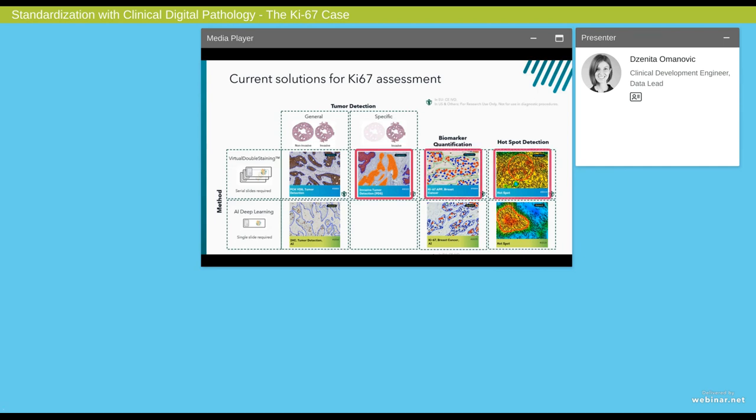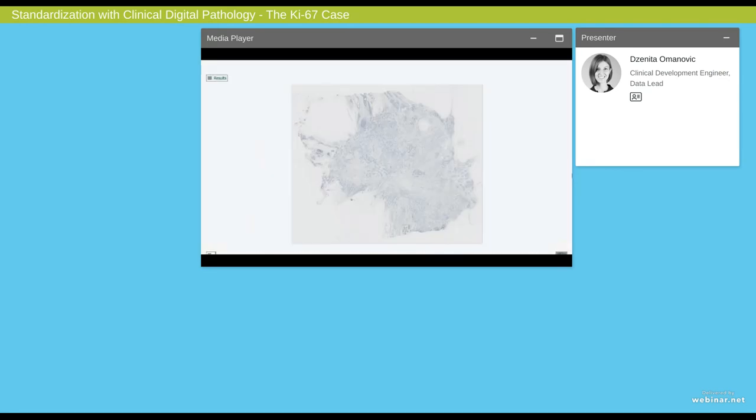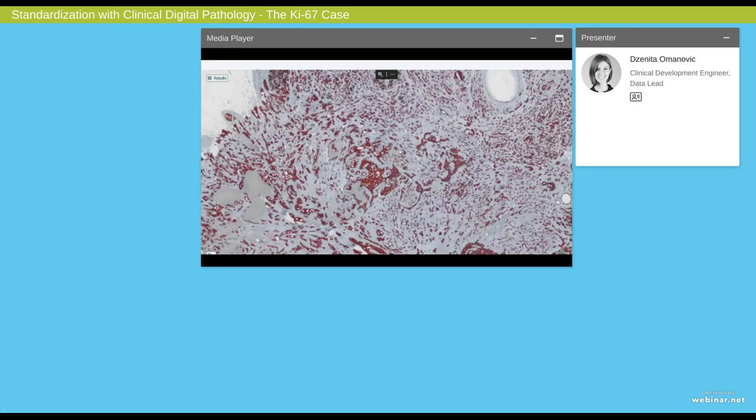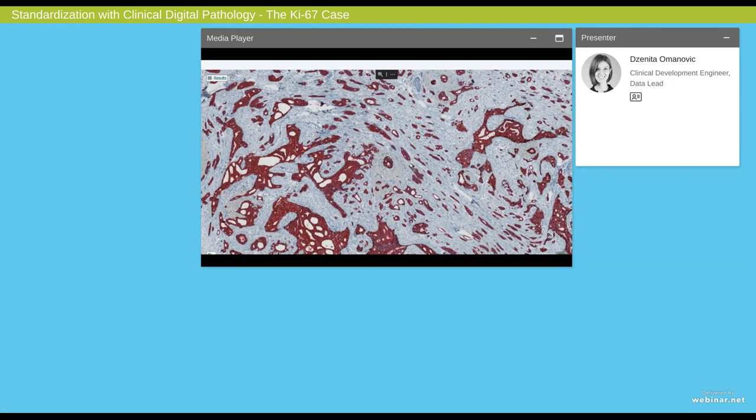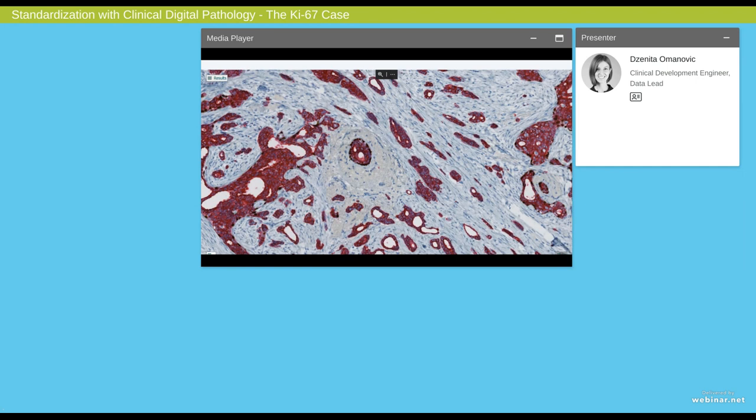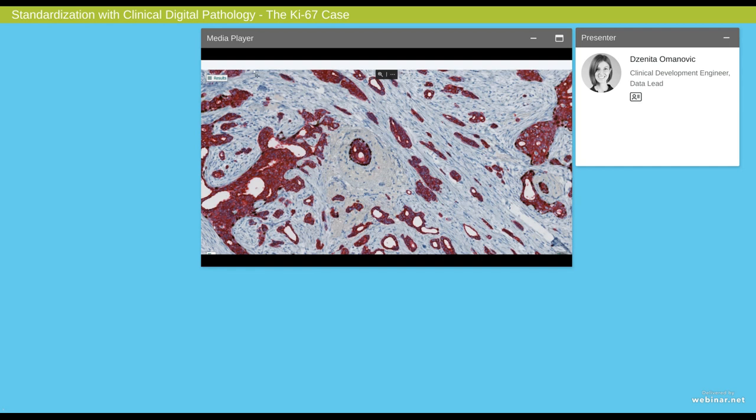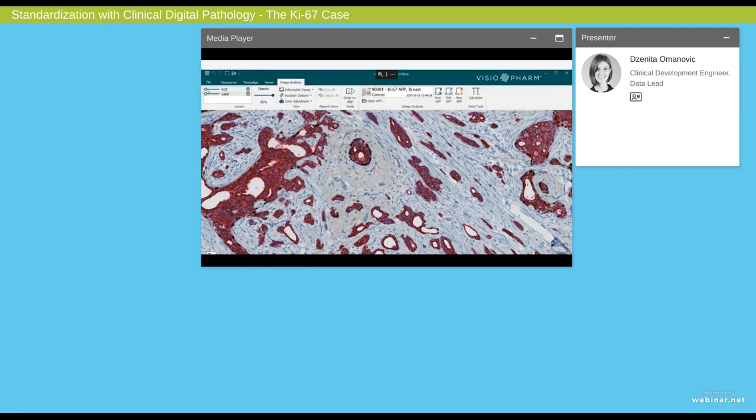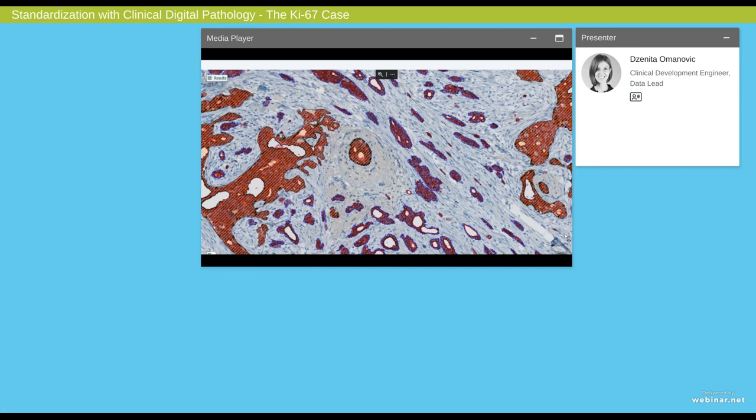What I want to show you is how our invasive tumor detection combined with the KI-67 app and combined with the hotspot app gives a fully automated KI-67 assessment. What we need to be able to conduct such analysis is that we need to have some breast cancer tissues stained for KI-67. This is what we see here, but then we also need to have a serial section that has been stained with P-63 and a cytokeratin. What the P-63 and cytokeratin stained section allows us to do is that we can go in and pinpoint what is invasive tumor and what is non-invasive. And this we can do based on the P-63 positive myoepithelial cells that we see in some structures.